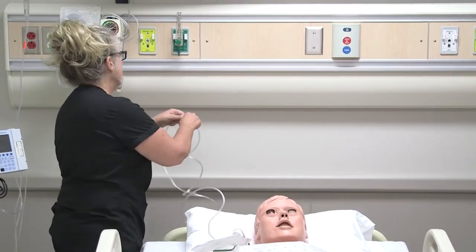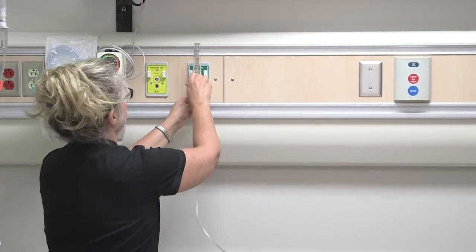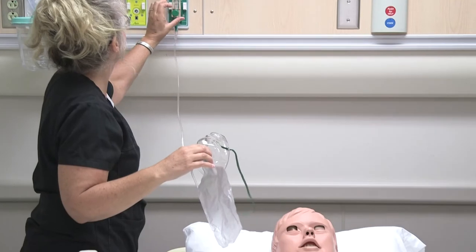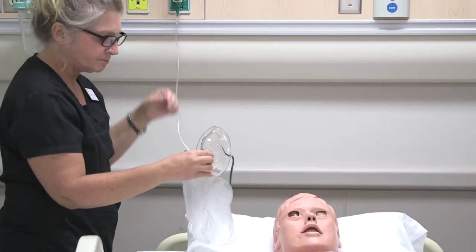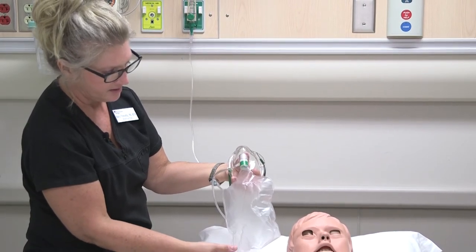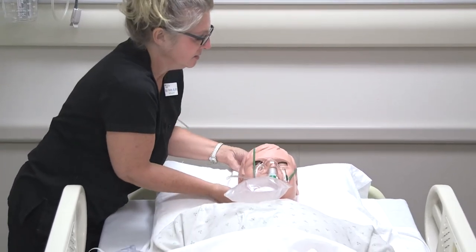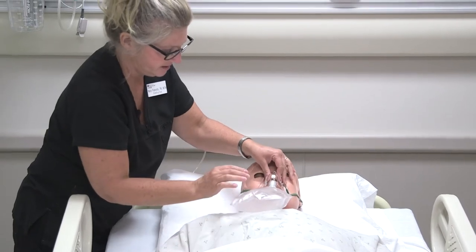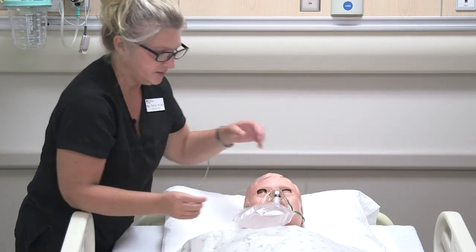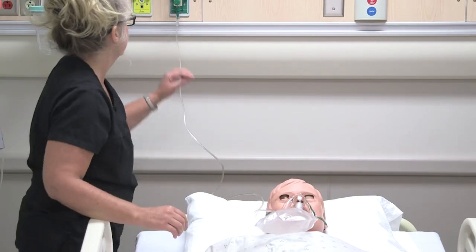This one is going to be at higher levels of oxygen flow — anywhere from about ten to fifteen. I'm just going to put it right at fifteen. You can see the bag is already filling up with oxygen. We fill that up and then you can put the mask on the patient and secure it the same as the simple mask. Again, we have that one-way valve where we're not allowing that carbon dioxide to mix. So that is a non-rebreather.